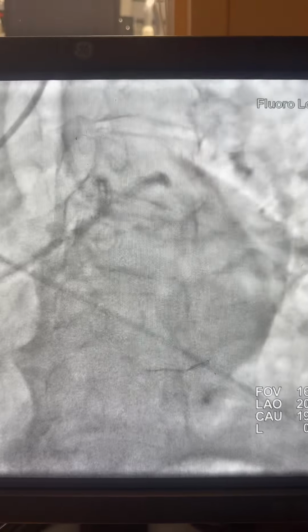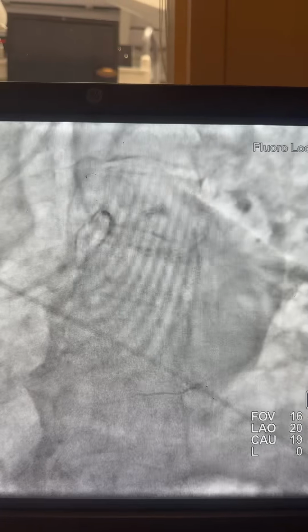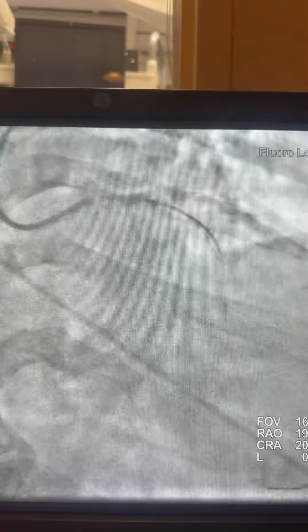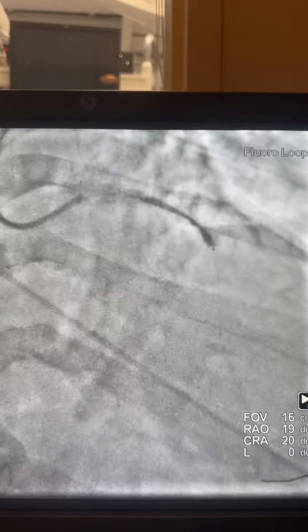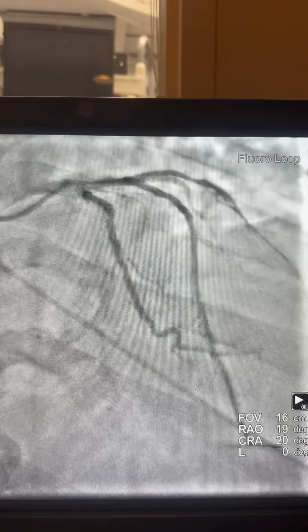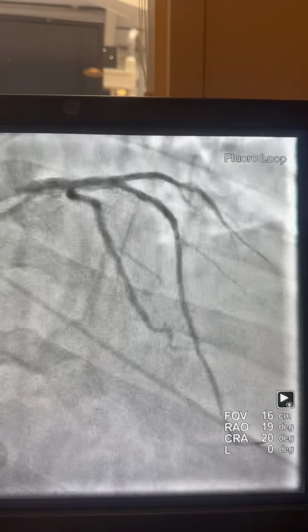And here is the 3.0/38 stent for the LAD. And then of course we're going to see the distal segment in the cranial view. And here is after inflation. I always save the fluoro to minimize the radiation. So if you see in all my practice, I do that instead of doing cine, and then here post dilating at high pressure in the LAD.